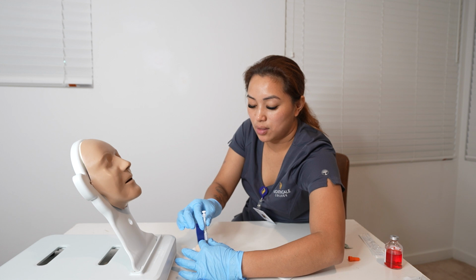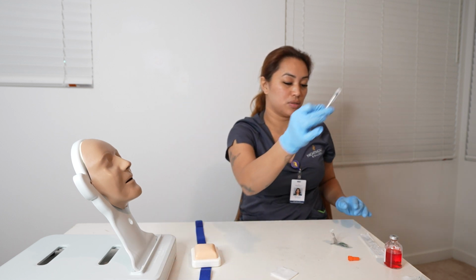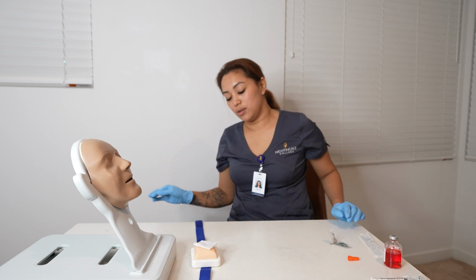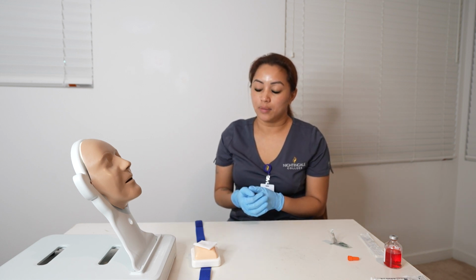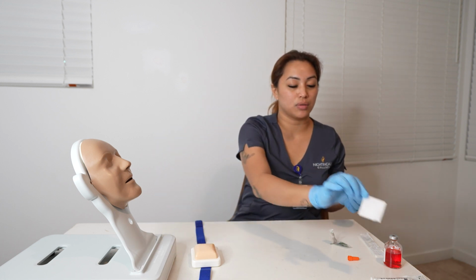All right, now we can withdraw the needle and put this into the syringe sharps container. Now we are going to place a gauze over the injection site. All right, perfect. Ms. Smith, are you okay? All right, do you have any questions? No. All right, perfect. It's not bleeding, so we can throw this away.